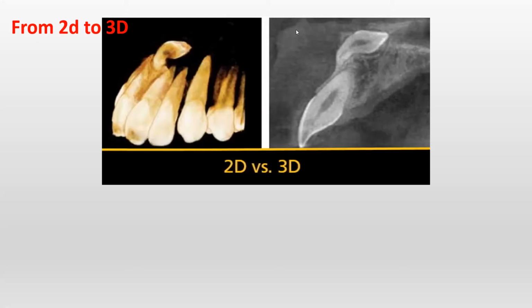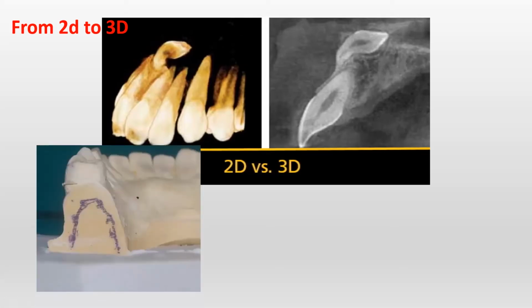Earlier, before CBCT, the third dimension was assessed based on ridge mapping, how we used to place implants using 2D. Here I would like to show you the ridge mapping being done using the IOPAs and the OPG. We make the cast and measure. Ridge mapping is a measurement procedure to ensure that the diameter of an endosseous screw implant does not exceed the dimension of the available bone.